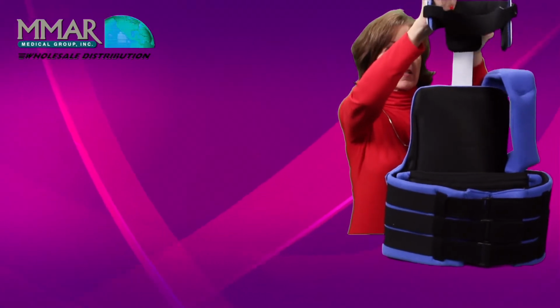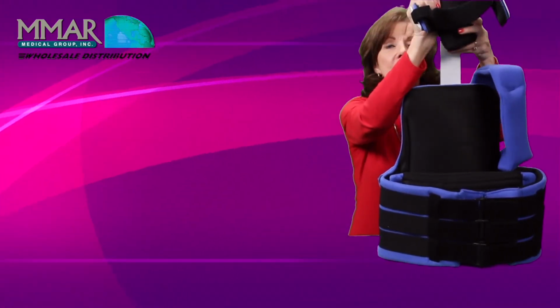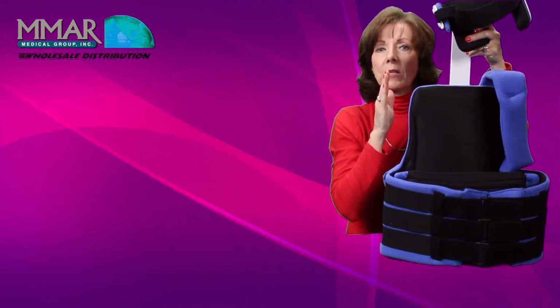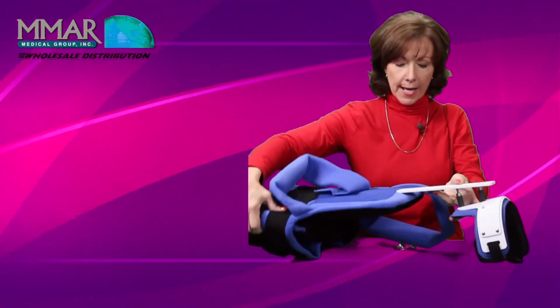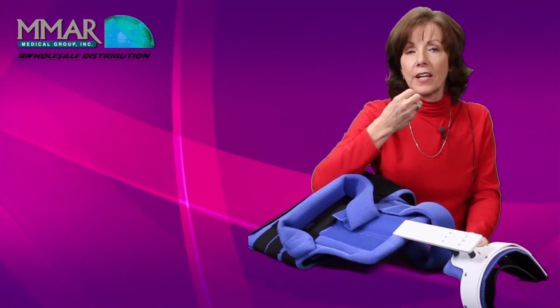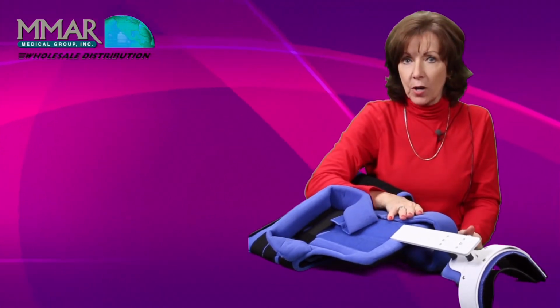pop this out, and it's snug because we don't want it roaming around. There. And you're going to stretch them to the opposite side. So these shortened muscles have a chance to overstretch, so you rebound back to neutral. Then you can go back here for maintenance. If you think of this like the dentist or orthodontist putting braces on your teeth, he or she is going to move your teeth and overstretch them to where they rebound back to where he wants them.